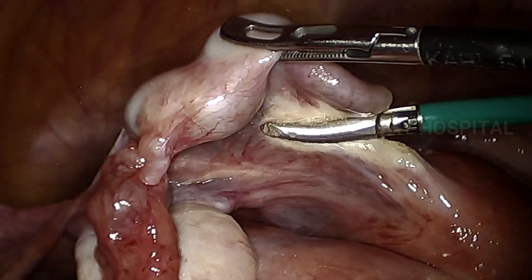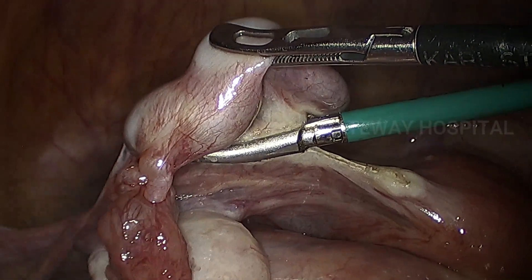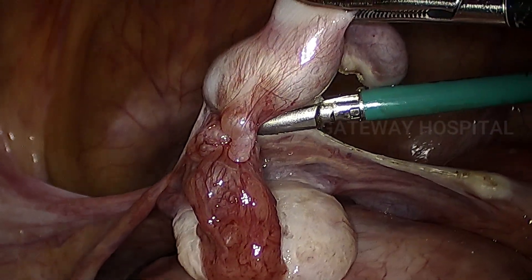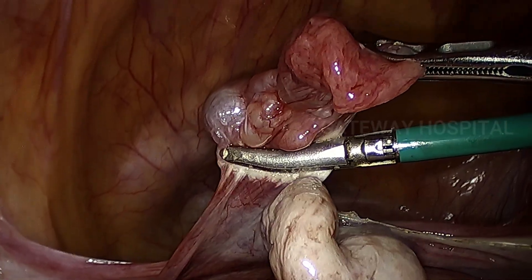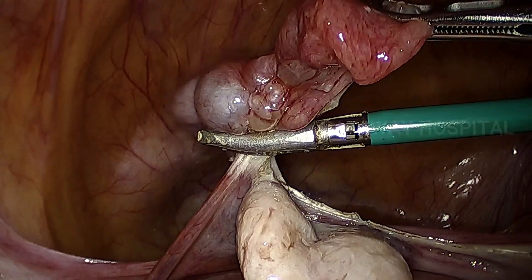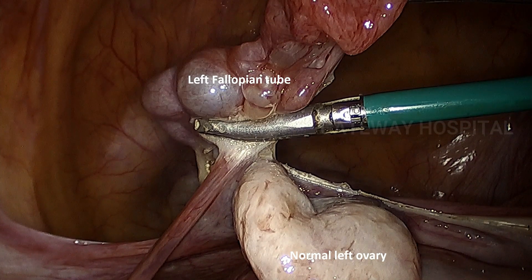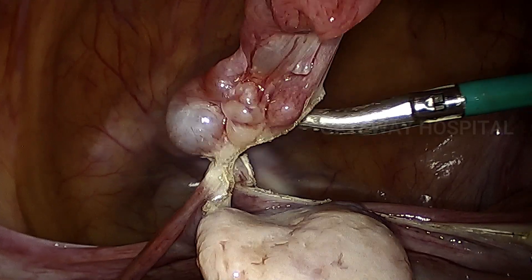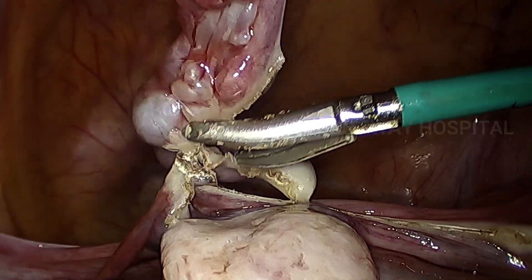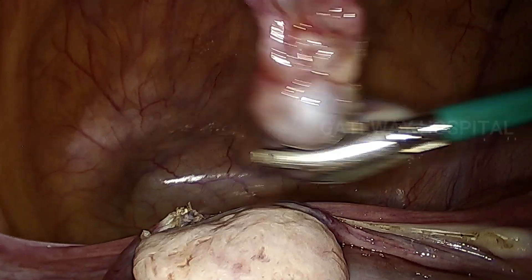Now we are dividing the fallopian tube on the left side, and this left ovary looks normal. You have to keep the specimen in the pouch of Douglas so that you will not be missing the specimen at the end of the procedure.